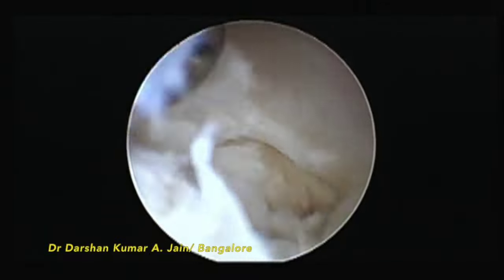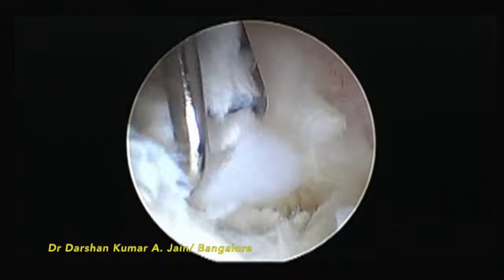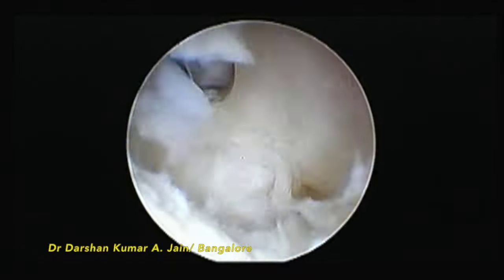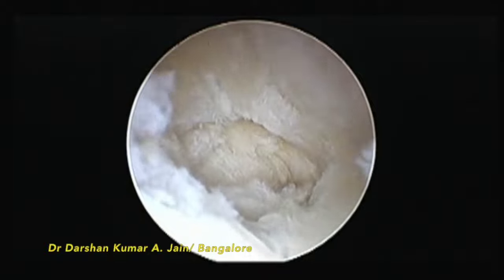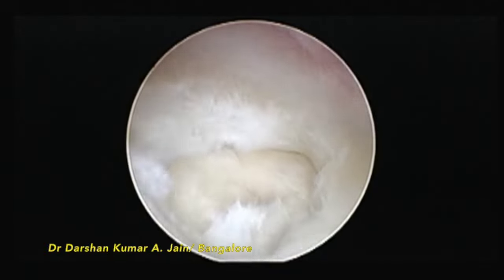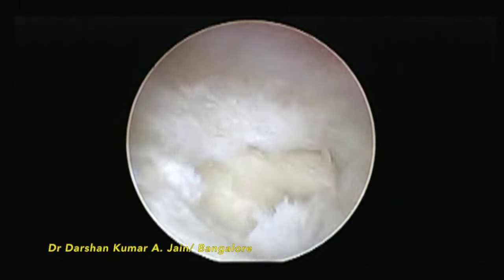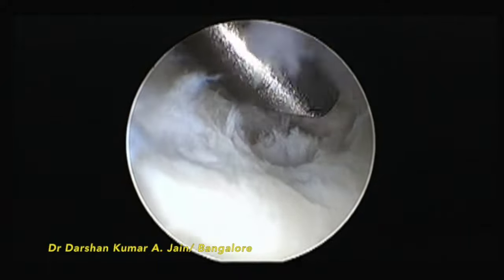Through an arthroscopic procedure, a small part of the TFCC was debrided to create a window, and an arthroscopic bur is used to debride the ulnar head towards the radial side.